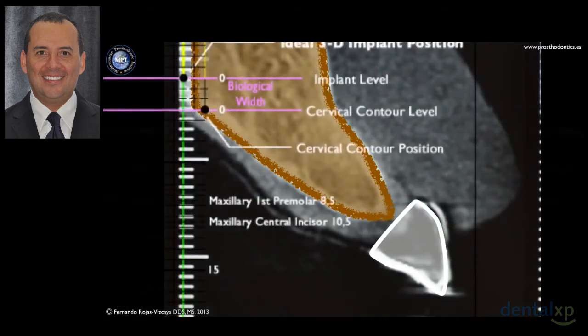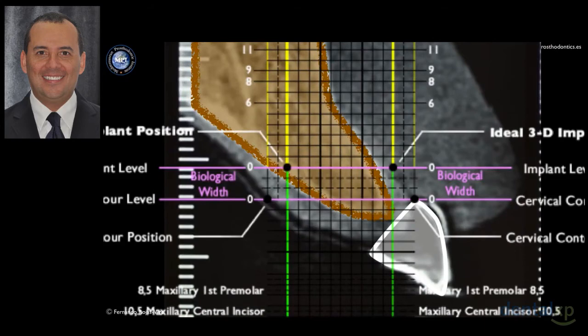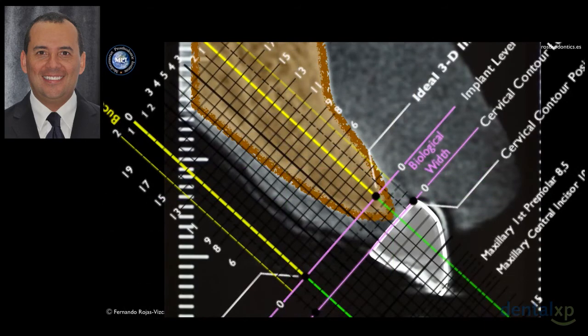So the rule, you can see this is 3 mm in the area of biologic width, so I can rotate the rule until it's in the correct position. Now in the space of 3A, you have bone. Can you see the difference with the molar? The bone is not at 3 mm. The bone is in contact with the margin. But we know that on average, the biologic width needs to be 3 mm. And when you make the analysis of the 2B, you can see that you have enough bone to maintain the 2B.